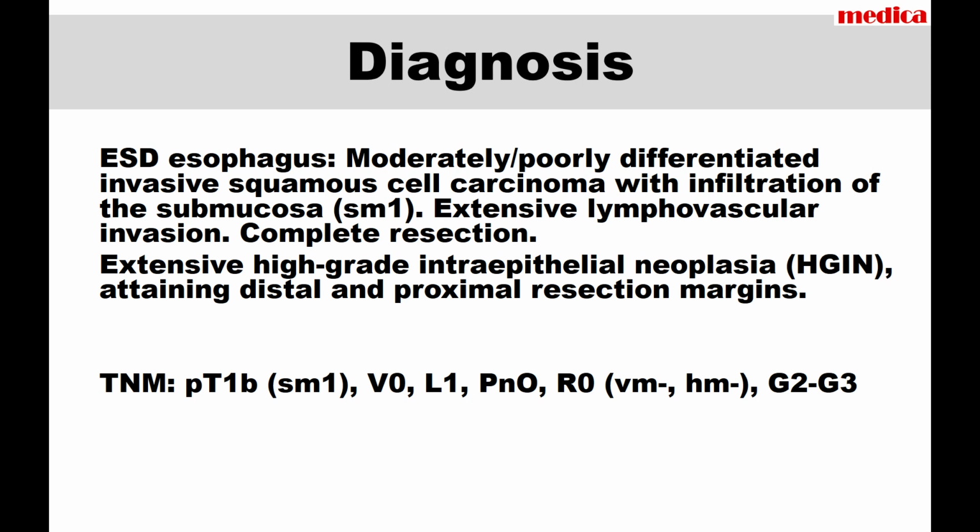But of course, on the endoscopic image, there is a depressed area, and the vascular arrangement becomes very irregular. So that suggests this histology, moderately to poorly differentiated, and also SM invasion. Actually, this patient has lymphatic vessel invasion. So definitely more than 40% risk of lymph node metastasis now and in the future. So surgery is another option. But beforehand, it's very difficult to decide.